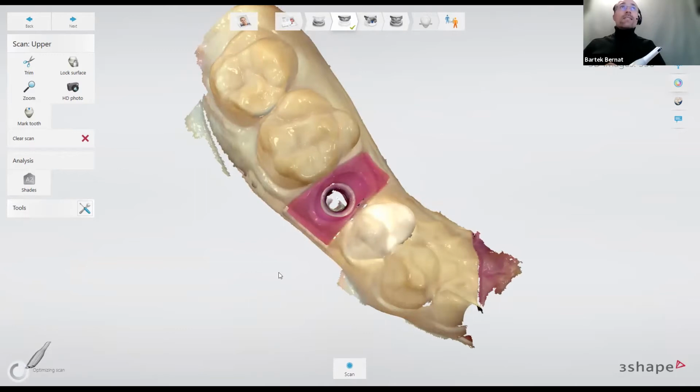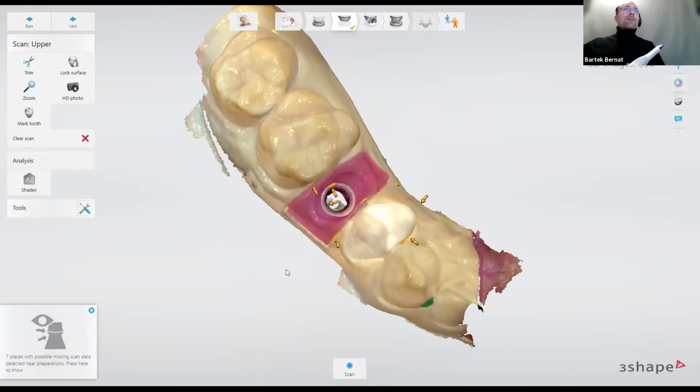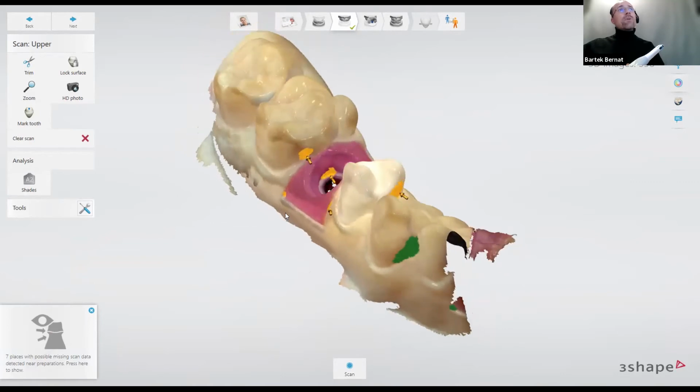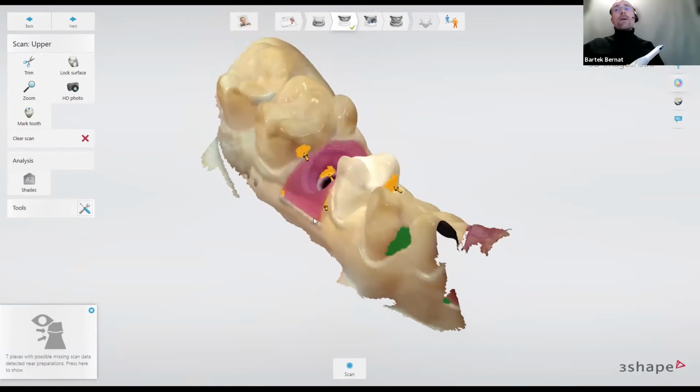That's going to be needed for the next scan that's just been enabled. So it's very important to mark as much in the middle as possible. As you can see, you have some points that we could scan a bit more. I'm just going to cover that in probably the next try. I will show you a bit of flavor in this scan.